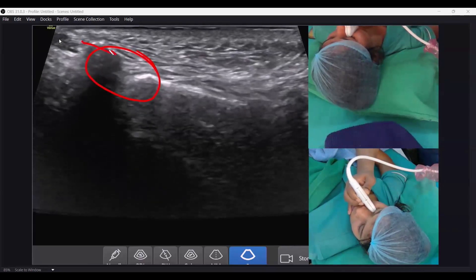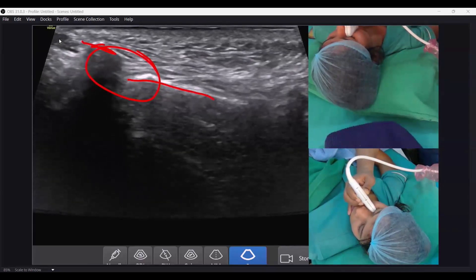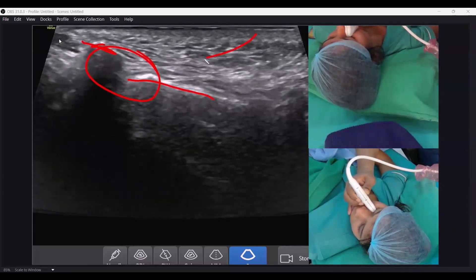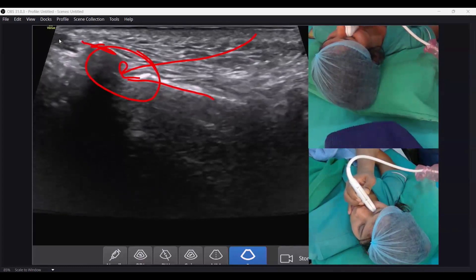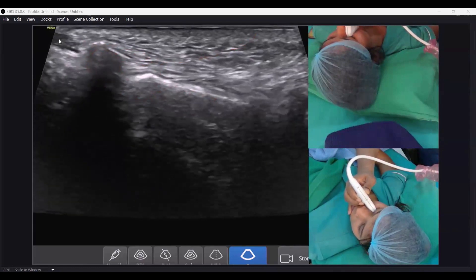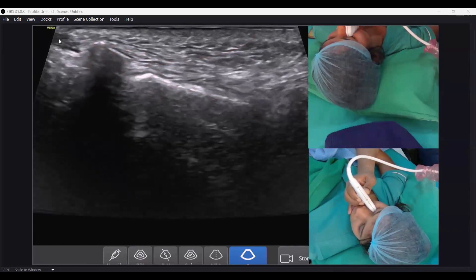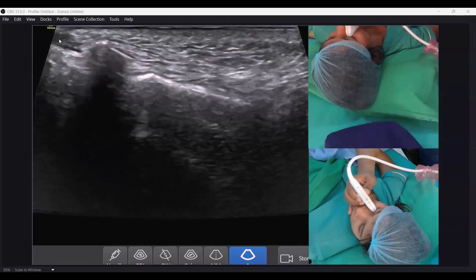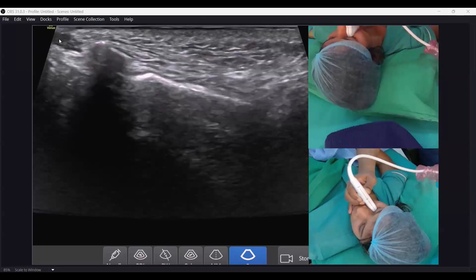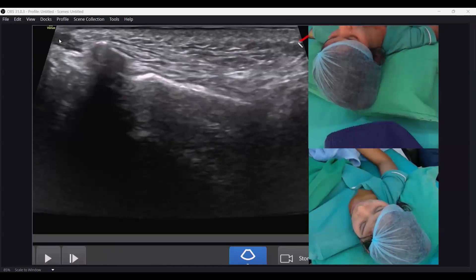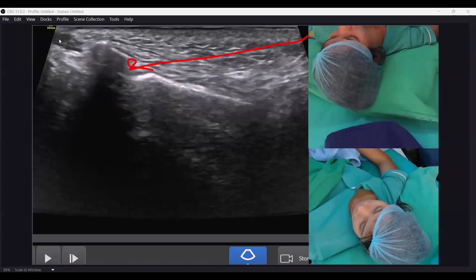This is the floor of the orbit, and this is the maxillary bone. Your needle should come like this and do the block — very easy, very simple. You cannot see the nerve, but you can always see the arterial pulses. Cryo is the choice here, so the needle should come like this. You can also do local anesthetic steroid, but it has very temporary relief. You cannot do an alcohol block here, and you cannot do a radio frequency block here.